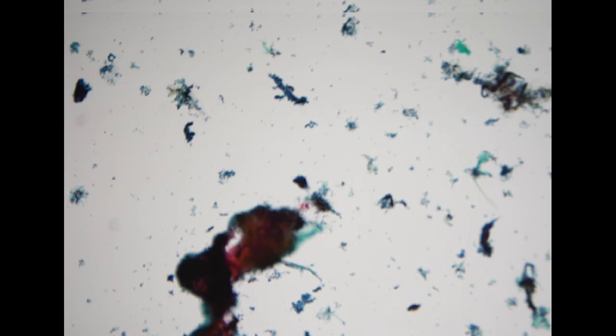So the next specimen is an EUS-guided aspiration cytology coming from a 56-year-old male, from the pancreatic body. On low power, this is an aspiration specimen, and we have a lot of cells. And the background seems to be quite busy.